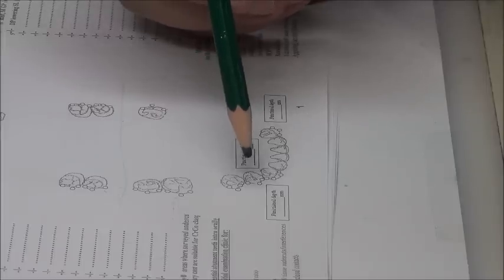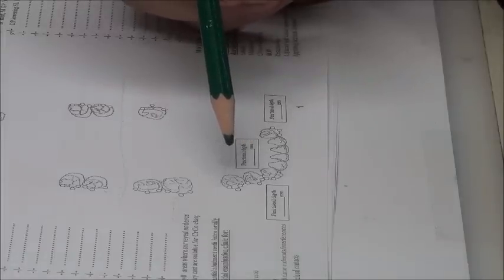Other than mesh, better for single missing teeth is the metal base with a pin in it. Okay, that's better. So, why? Because I could better produce a clearance for the marginal gingiva. So the acrylic will not be touching the tooth.